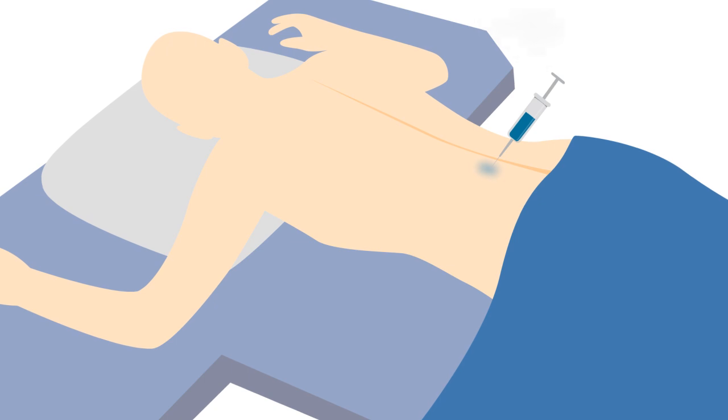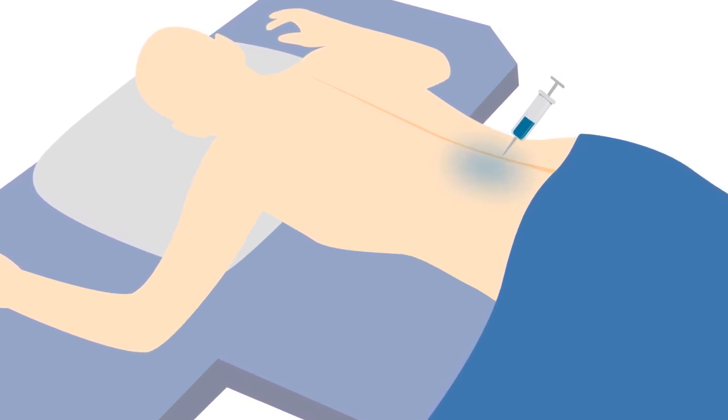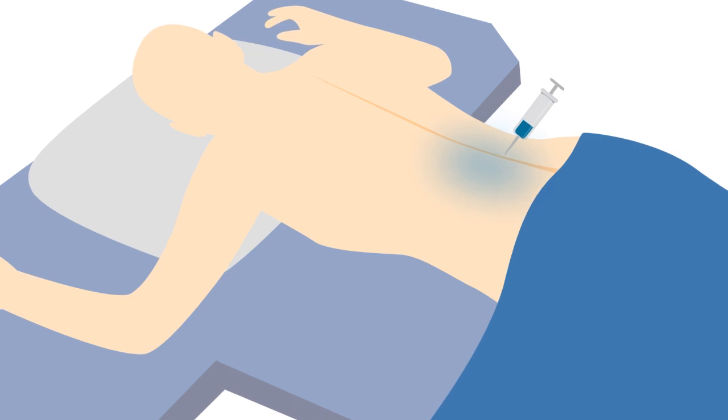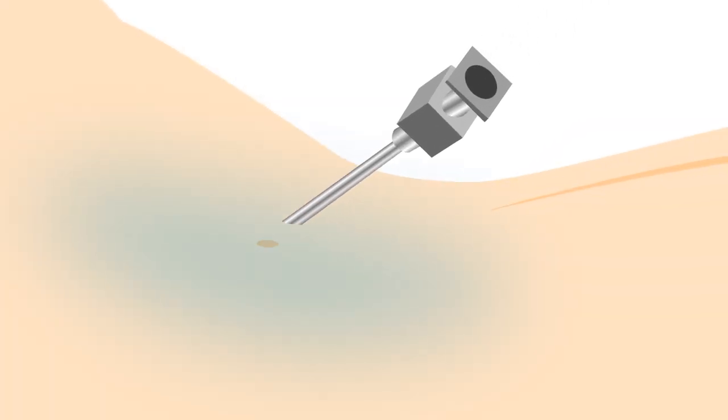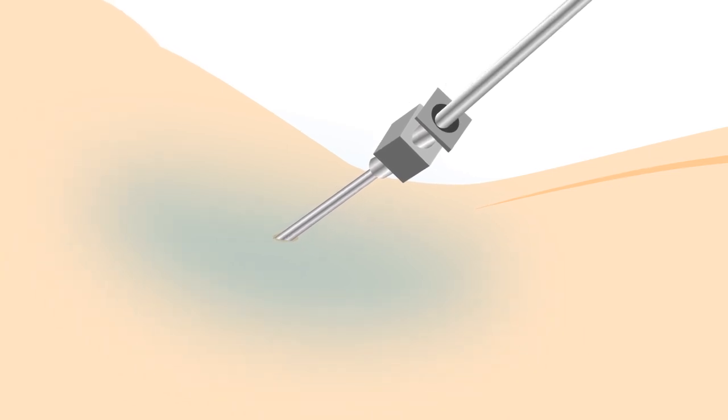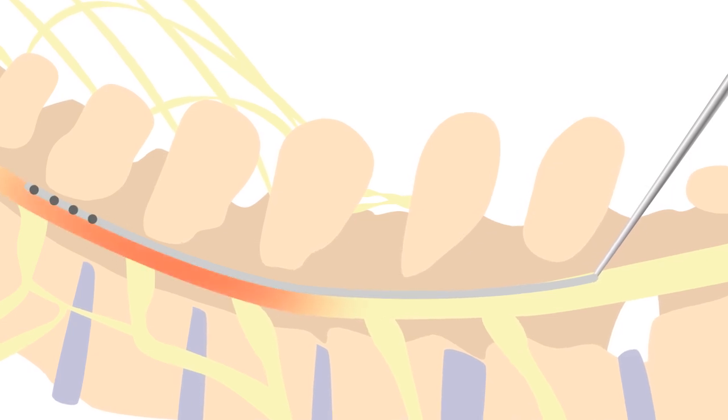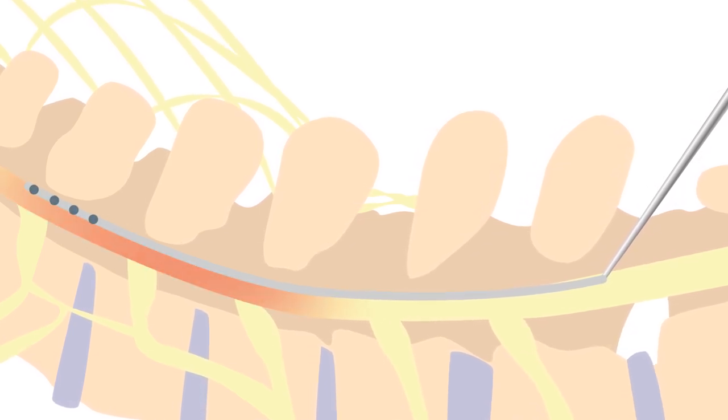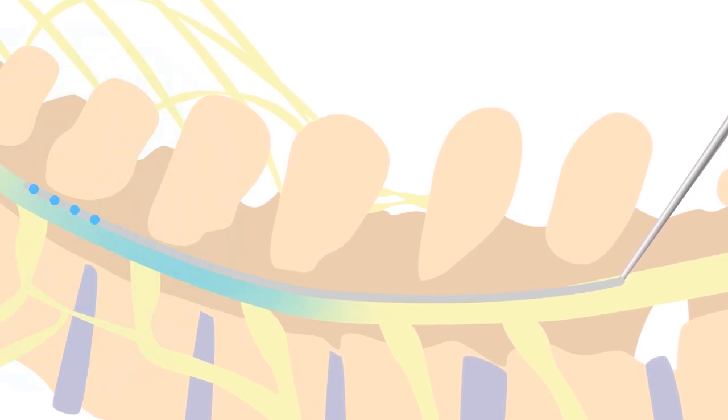Prior to a final spinal cord stimulator being placed, a trial procedure is necessary. For this, the lower back is sterilized and anesthetized, and a small incision is made to delicately insert the electrode into the epidural space around the spinal cord. The electrode is then stimulated from a programming unit that is attached outside the skin, and the patient relays feedback regarding coverage of the painful area.